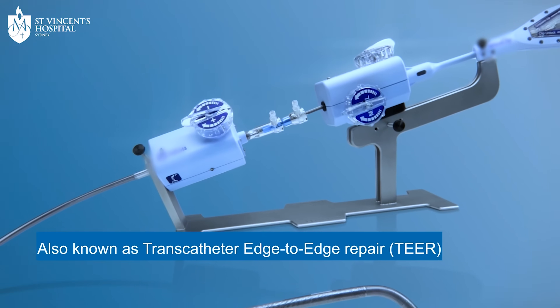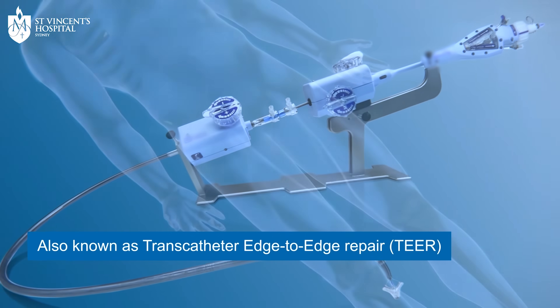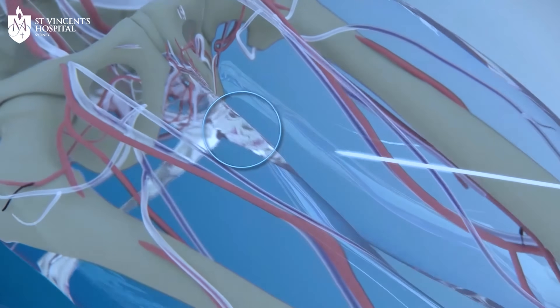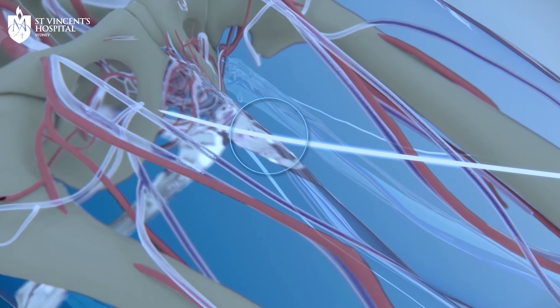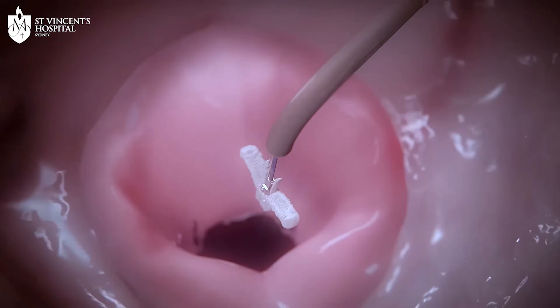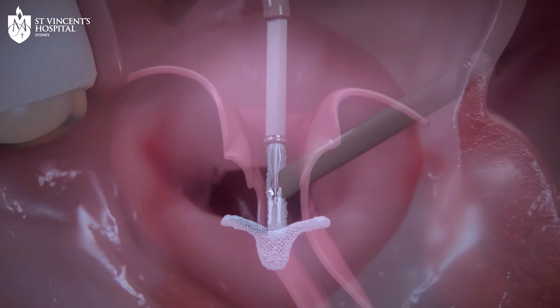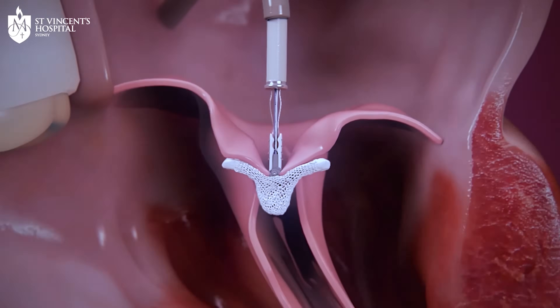Transcatheter mitral valve repair with a mitral valve clip involves passing a catheter through the femoral vein, the main blood vessel in the upper leg close to the groin. Once in position, the cardiologist identifies the part of the mitral valve that's leakiest and clips the two valve leaflets together.